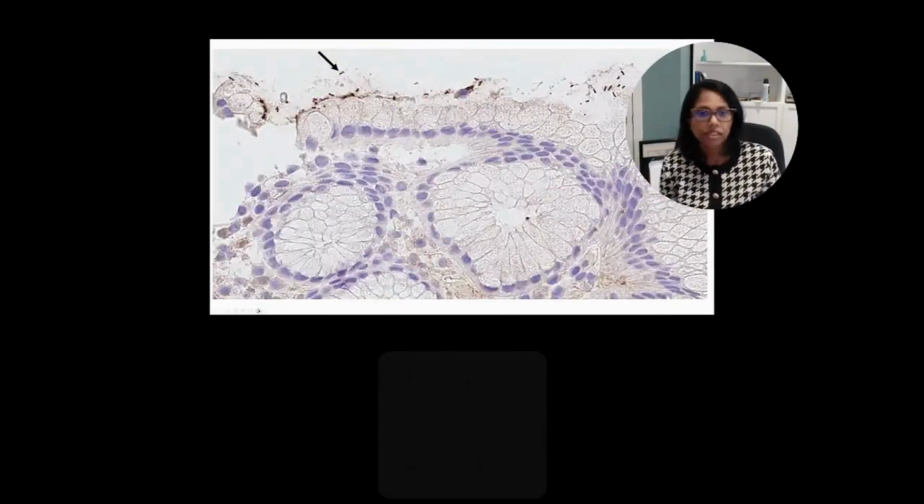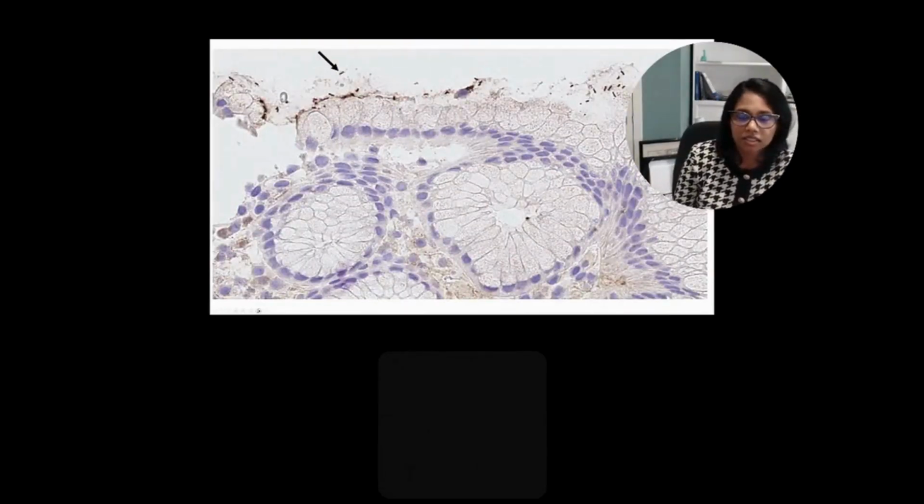I have an image here. The only reason I included this H. pylori immunohistochemistry is to demonstrate that seagull-like pattern that you see, if you at least indulge me. It does look like a bit of a bird, so perhaps we could go with that.